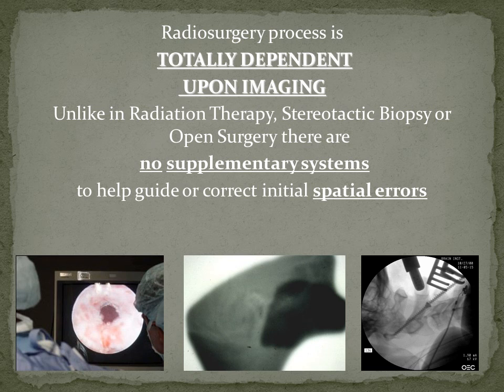Okay. Now, when we talk about things being totally dependent upon imaging, these procedures are not. When you're actually using fiber optics to see where you are, you're not relying on your preoperative or intraoperative imaging. You're doing actual live visualization.